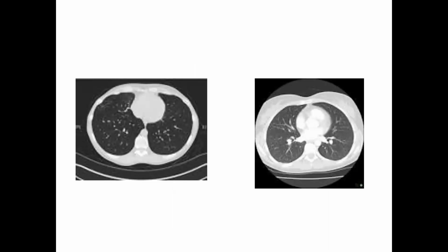So a CT is pretty cool in that it allows you to have closer looks at pathology or whatever that you might see going on. So I'll just draw a stick figure. If you've got a stick figure patient, they'll be lying in the supine position. And ultimately a CT takes images, slices of their body. So it basically slices them up, and as you transition through this, it would almost be like you're standing at the foot of the patient, looking at them from an inferior view to their head.